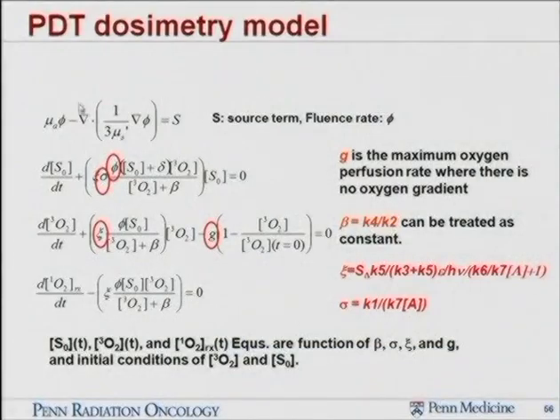So if you look at this diagram here, this quantity we have calculated is really not the singlet oxygen production rate. This quantity really is the singlet oxygen reacted with the tissue targets. And that is the reason this quantity becomes a cumulative quantity. As you're treating longer and longer times, this is a cumulative reactive singlet oxygen.